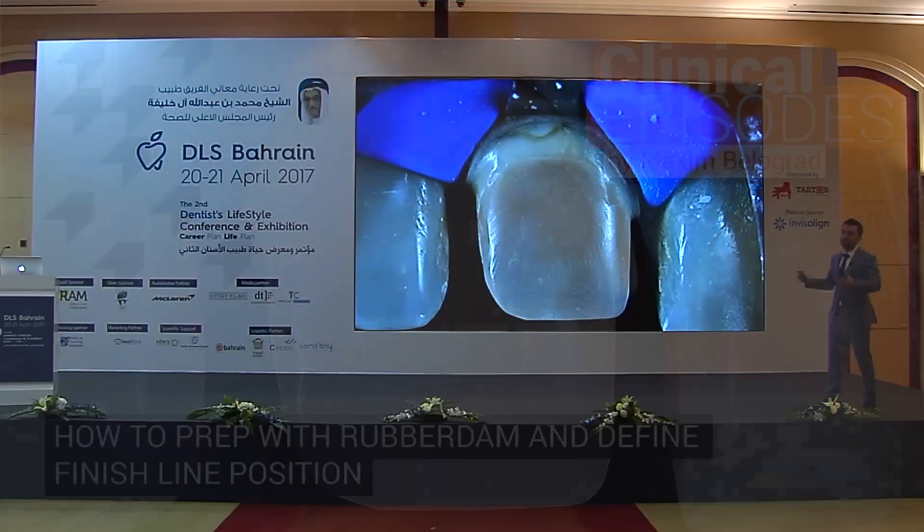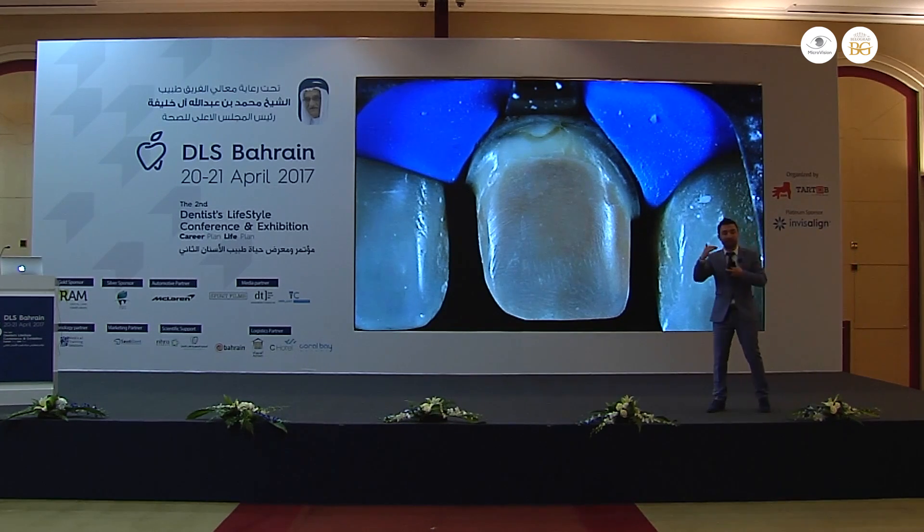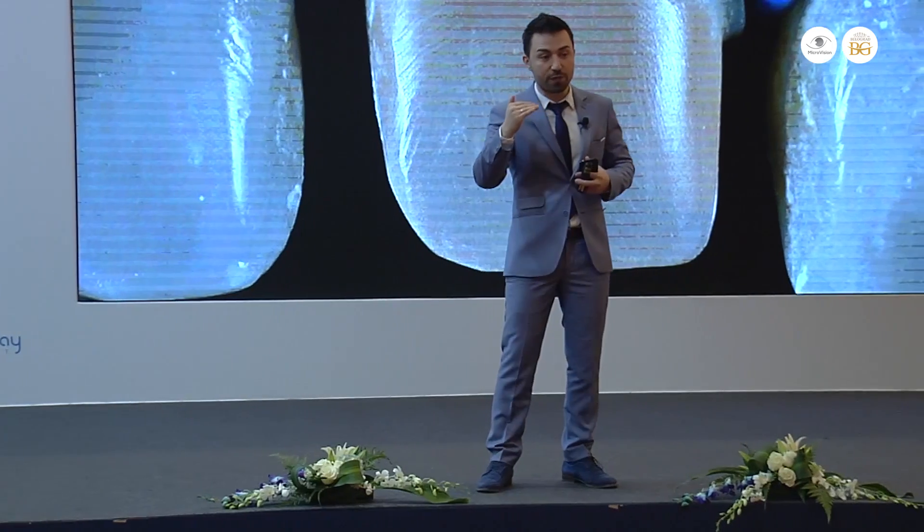This is the almost finished preparation with the rubber dam. Some people ask us, for example, how can we evaluate the position of the finish line cervically when you work with the rubber dam. And the answer is pretty simple. There are two basic ways how you can evaluate the position of your finish line.